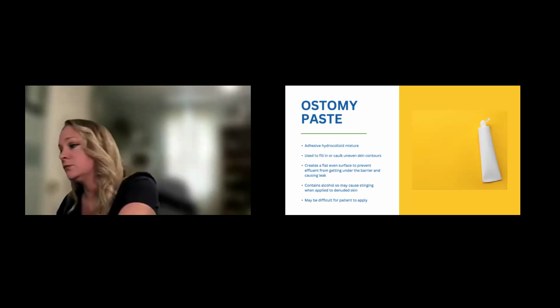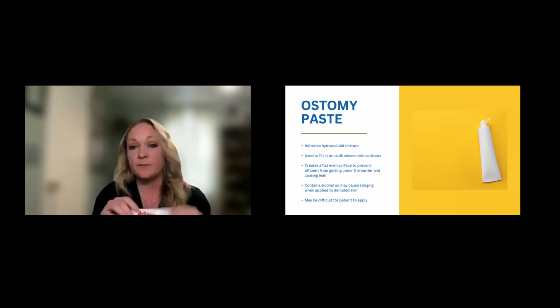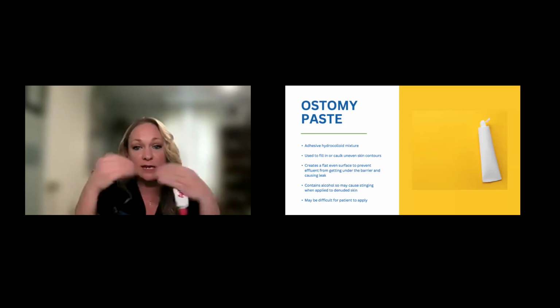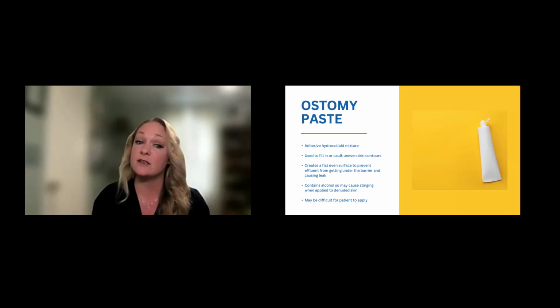Okay. Next, we have ostomy paste. So this is an adhesive hydrocolloid mixture. It's used to fill in and caulk in any of those uneven skin contours that we find. And that's going to help create that flat, even surface to prevent the effluent from getting up underneath the ring. It does contain some alcohol, so you want to make sure that you notify your patient. It can cause some stinging if you're applying it to some denuded or open skin.